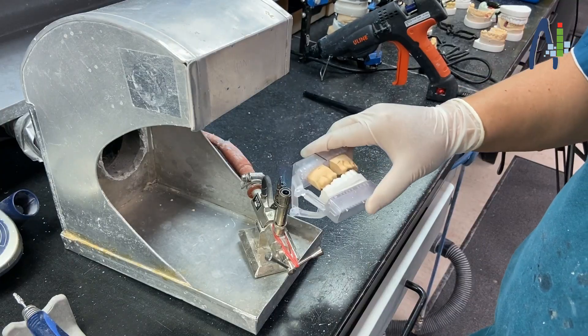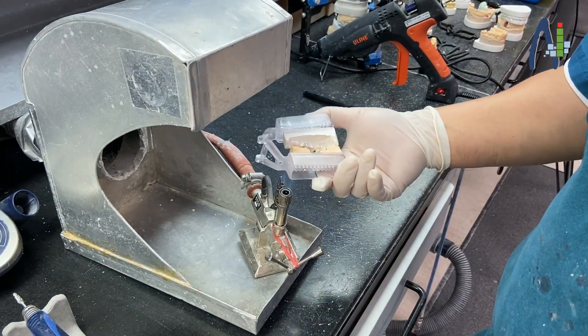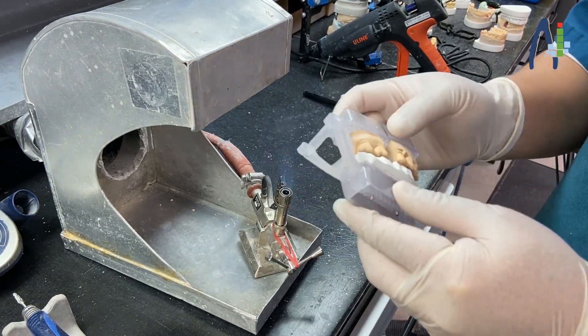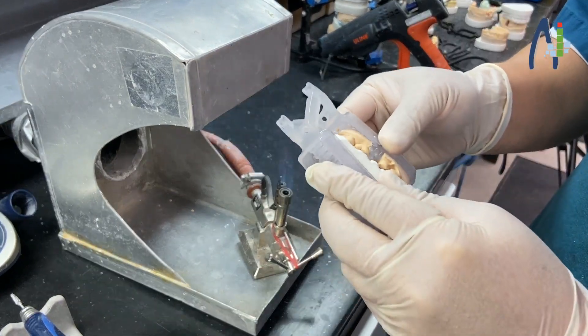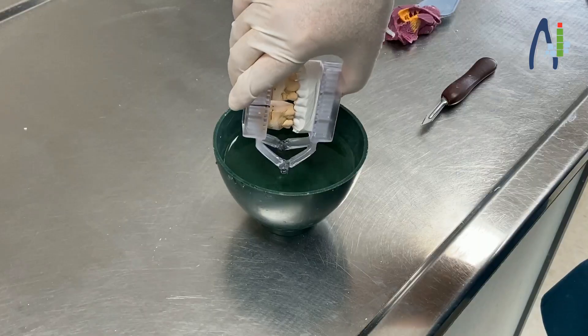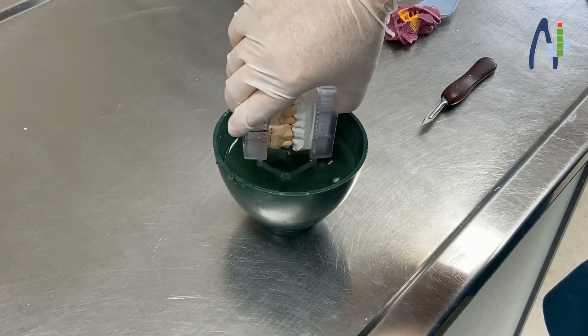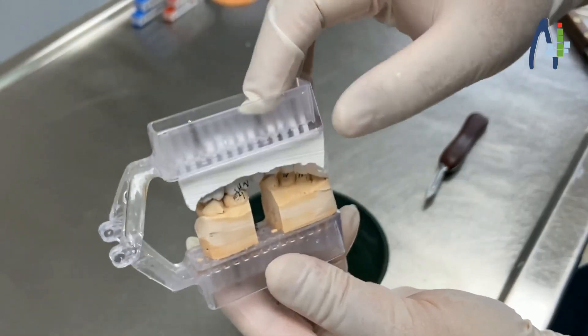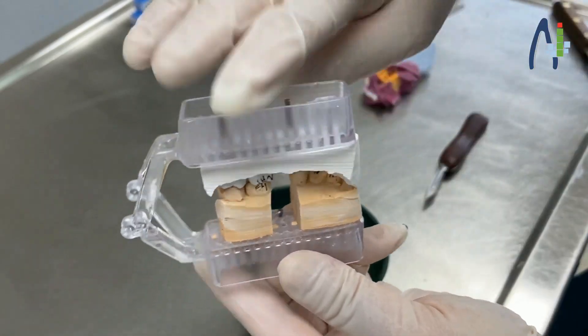You can also torch the bridges to adjust the occlusion. Grab the AICL bite and cool it down in cold water. Thanks to the well-fitting pins, the models are stable.